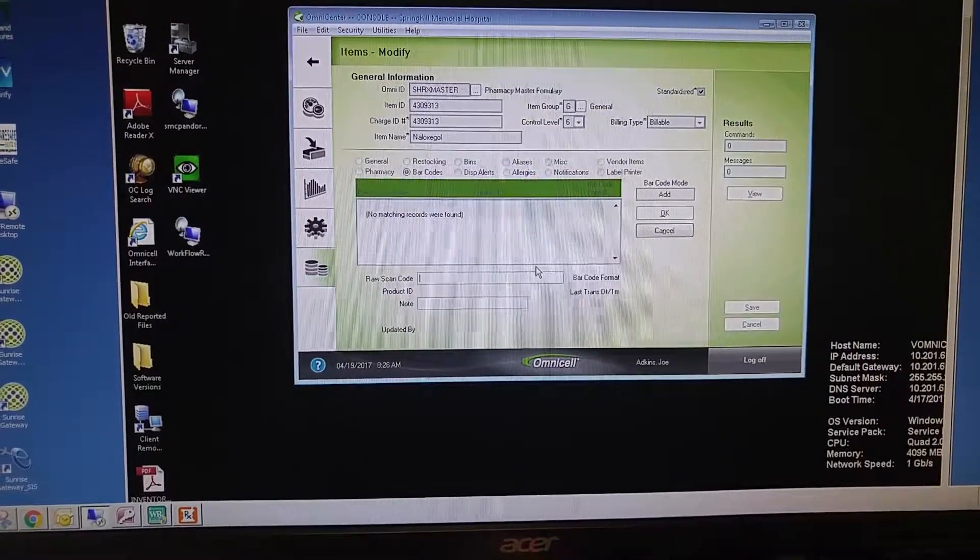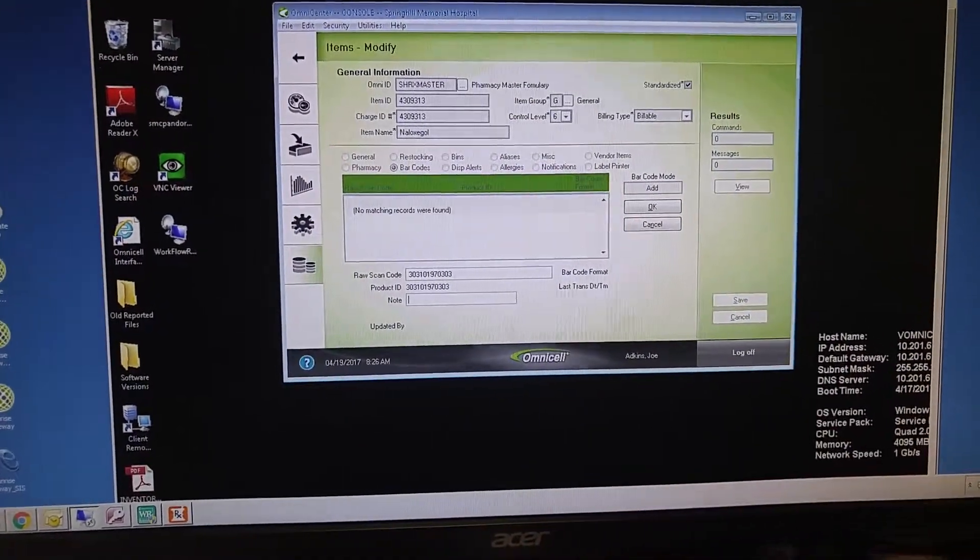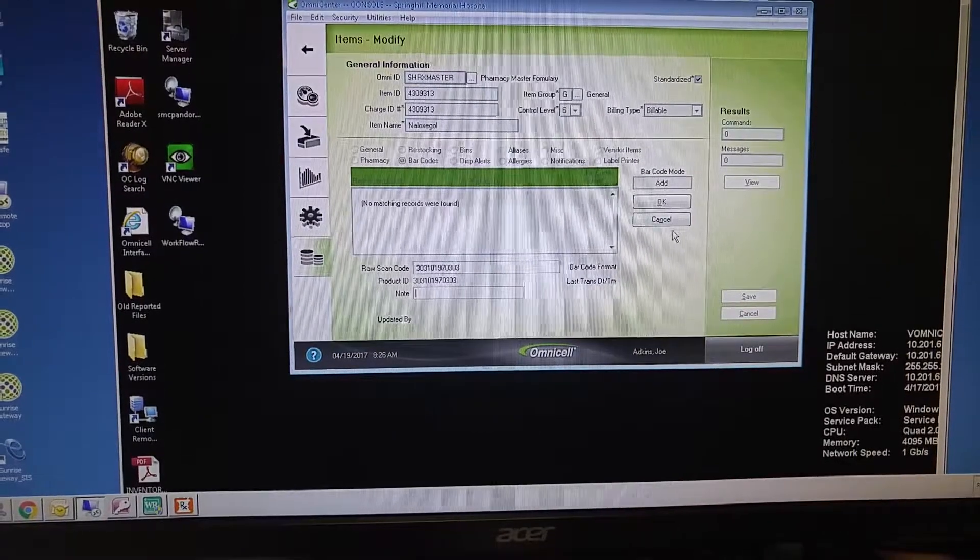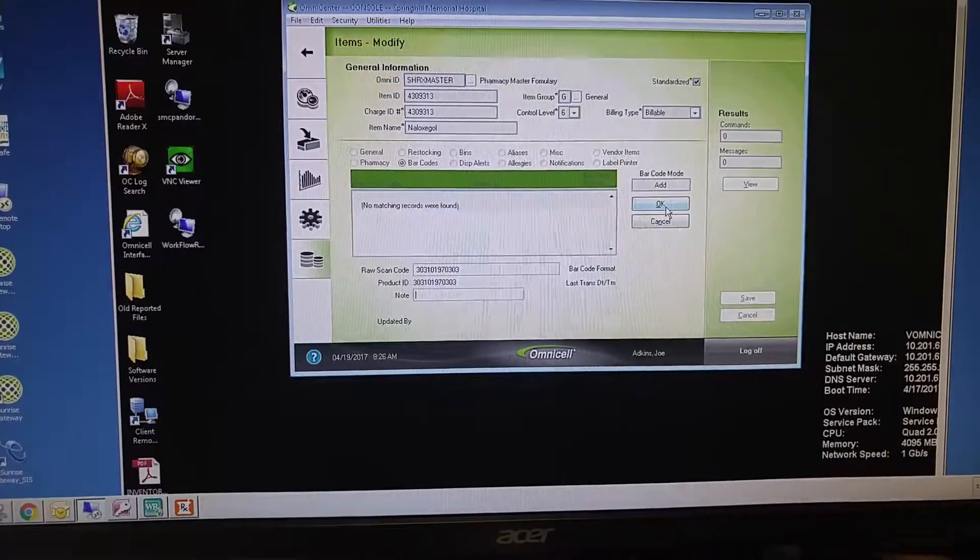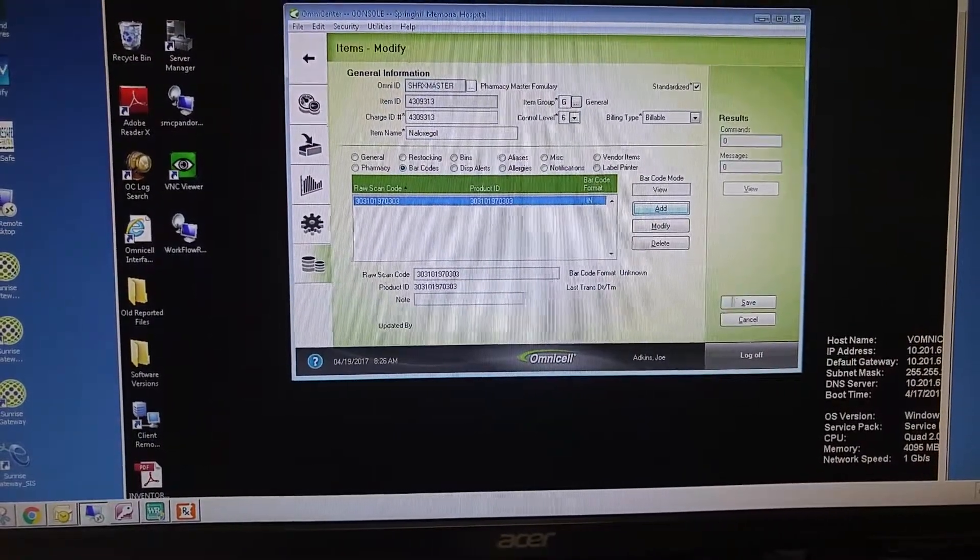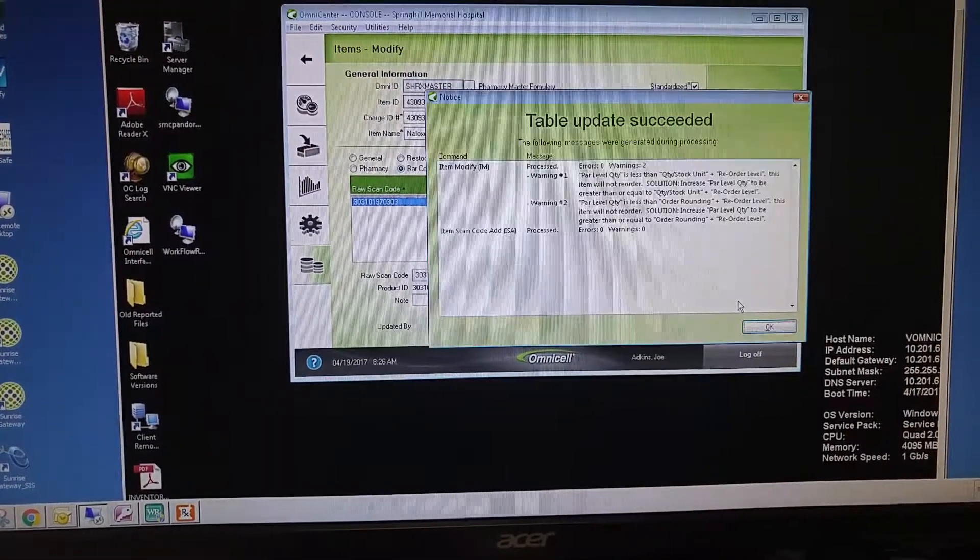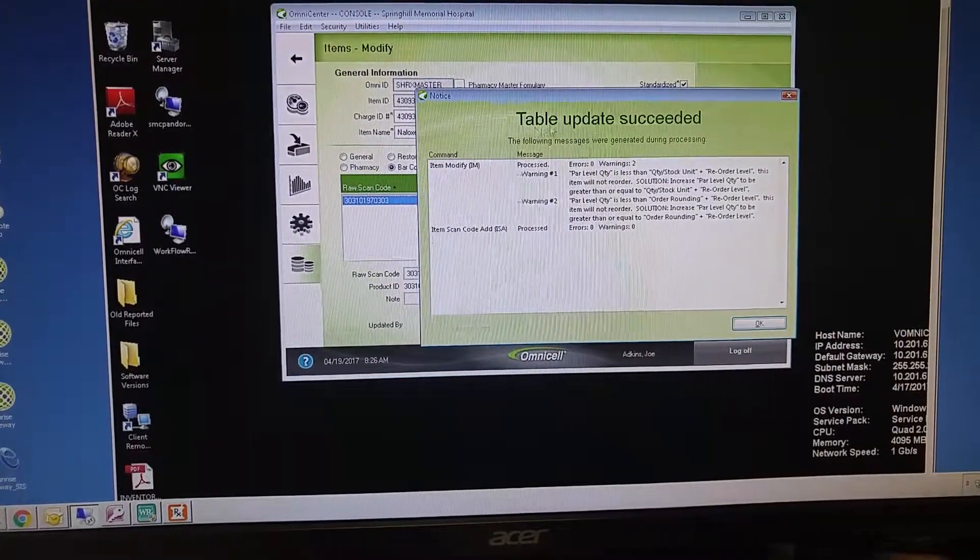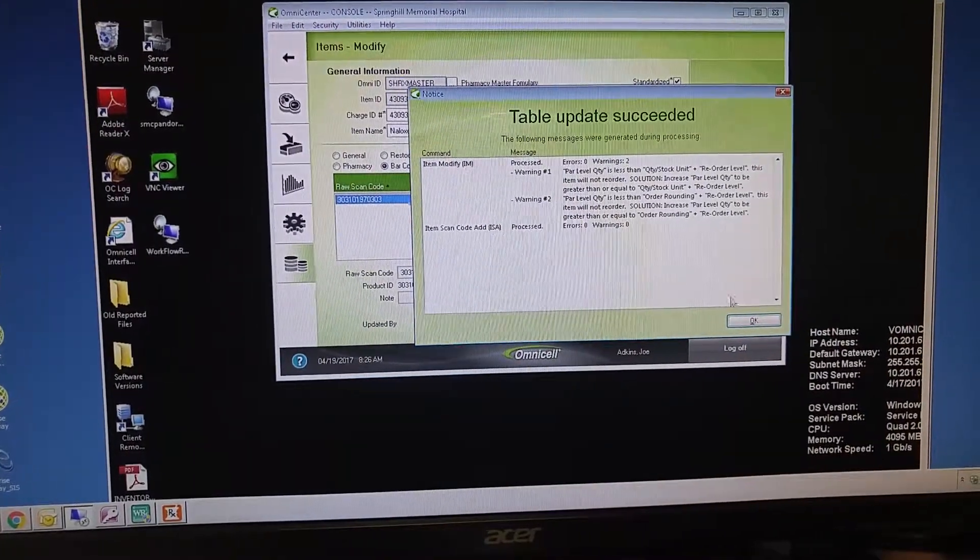Scan the item, and we will hit OK and save. It will tell you that that was successful.